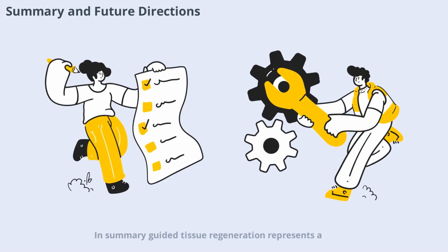In summary, guided tissue regeneration represents a major advancement in periodontal therapy, offering solutions for gum recession, root sensitivity, and aesthetic concerns. While the technique has clear advantages, such as reduced discomfort and natural-looking results, it also presents challenges like technique sensitivity and additional costs.